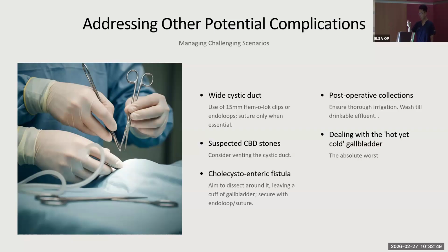I will usually put an endoloop around distal to the bowel cuff. That's one, but I wouldn't trust it, and I'll overrun it with a suture. And the idea is not to narrow it. So if it's a real fistula where you see enteric contents coming out, you close it transversely always. I'll run it down and up again with the same length of stitch.